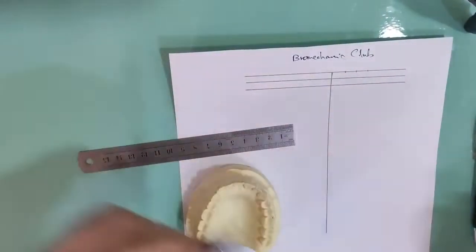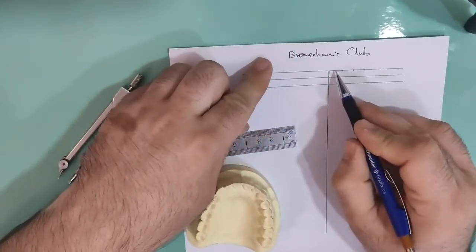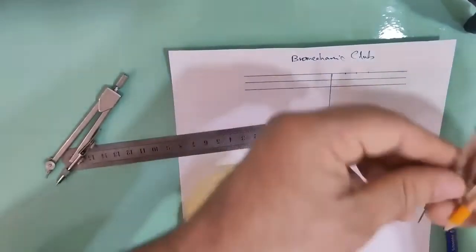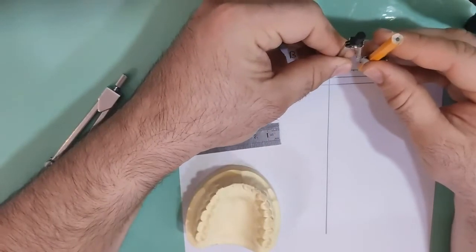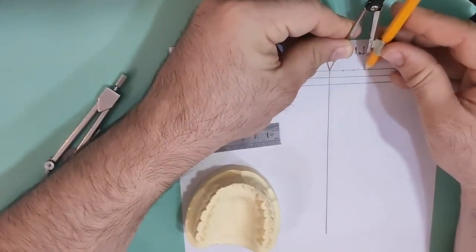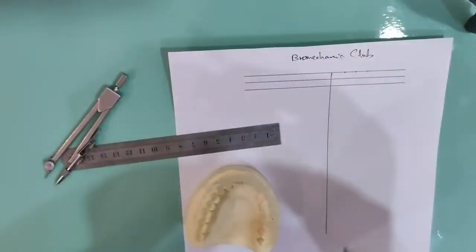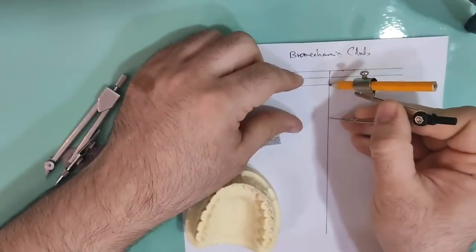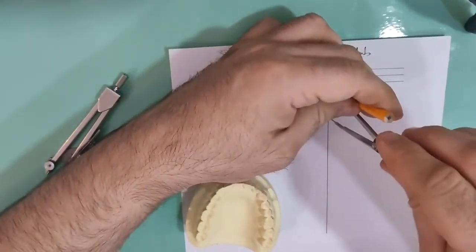So we have here three points: meso-distal width of central, lateral, and canine. We use this one with pencil and determine the radius by adding the three widths. We put the pencil and the other side on this line and draw a circle.